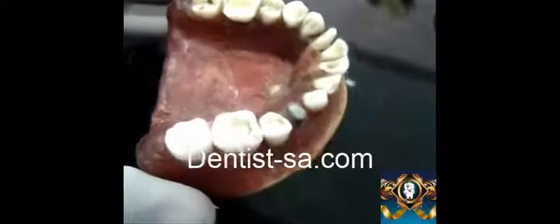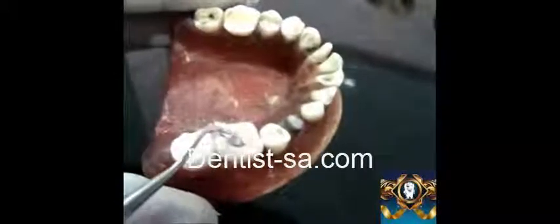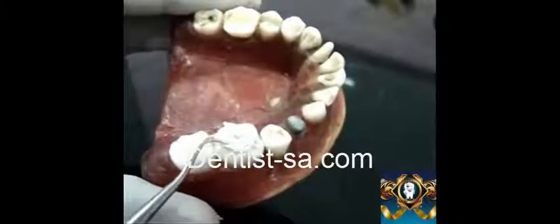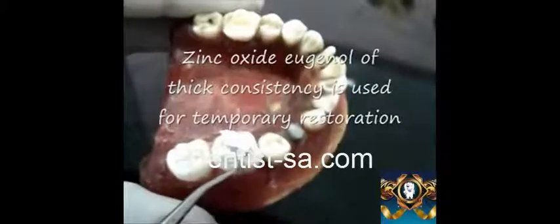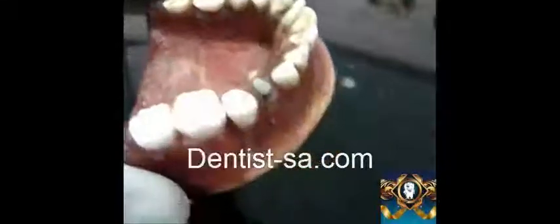Once the calcium hydroxide liner has been set, it was evaluated using the periodontal probe. A temporary restoration of zinc oxide eugenol of thick consistency is taken in a plastic filling instrument and restored into the prepared cavity. Once the calcium hydroxide has been sufficiently placed, a wet cotton pellet may be used to press the cement into the cavity for proper adaptation.